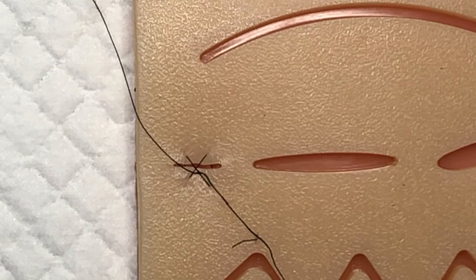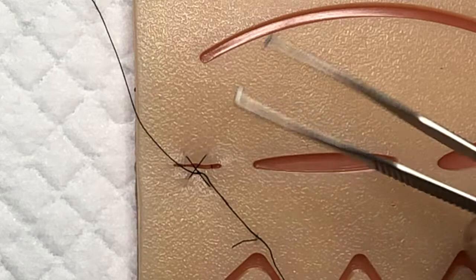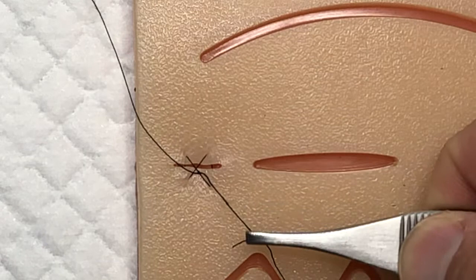So that's a figure-of-eight stitch — very helpful, easy to do. You don't even have to use a laceration kit; you can use a suture removal kit that has tissue forceps to hold the needle and introduce it through the tissue. Most suture removal kits also have a pair of scissors, so you don't have to open a more expensive laceration kit. You can just do it with a suture removal kit. That's it — thanks everyone.